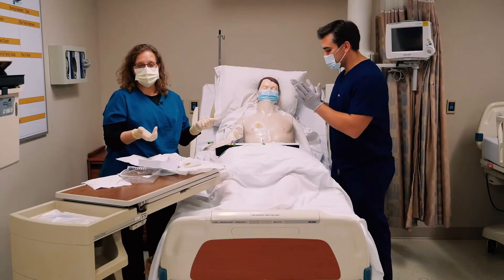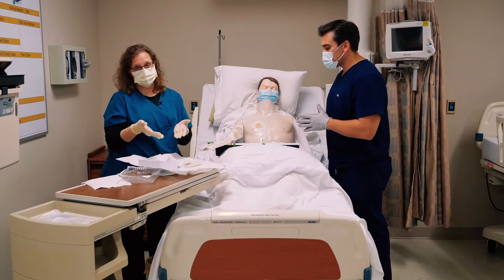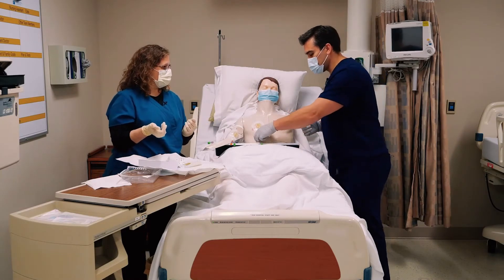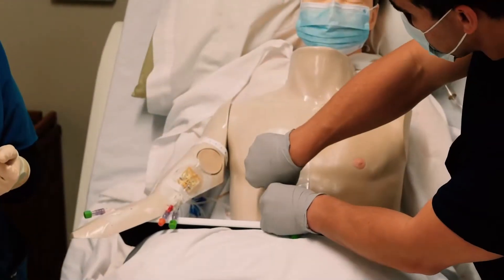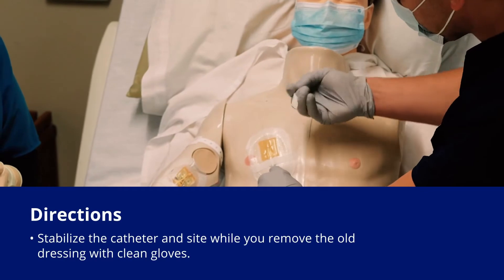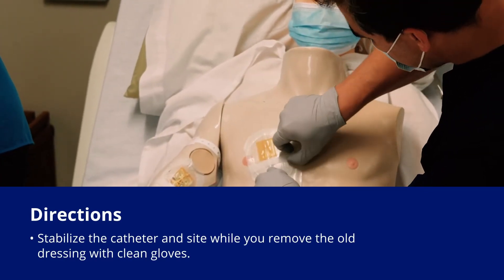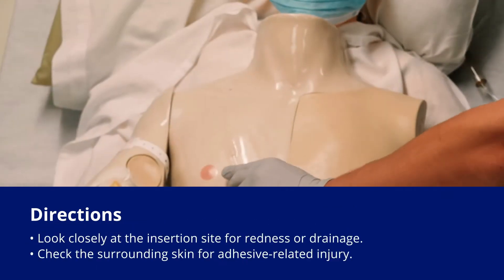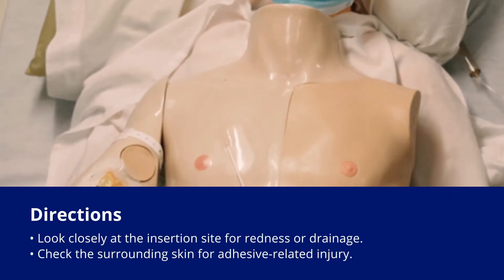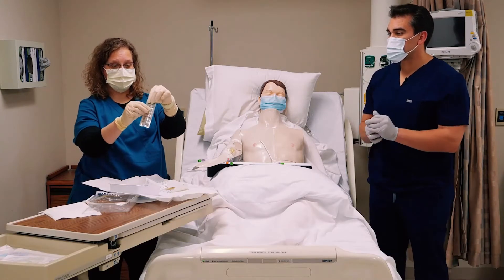Taking off the dressing itself is a dirty-ish procedure, so he can just take that off entirely. One of the biggest things — just like with an IV — is holding it in place, because when you're pulling these off you don't want to accidentally pull out the subclavian line. Now we've got a clean site. This is a skin protectant swab — I'm going to open it and use it toward the end.